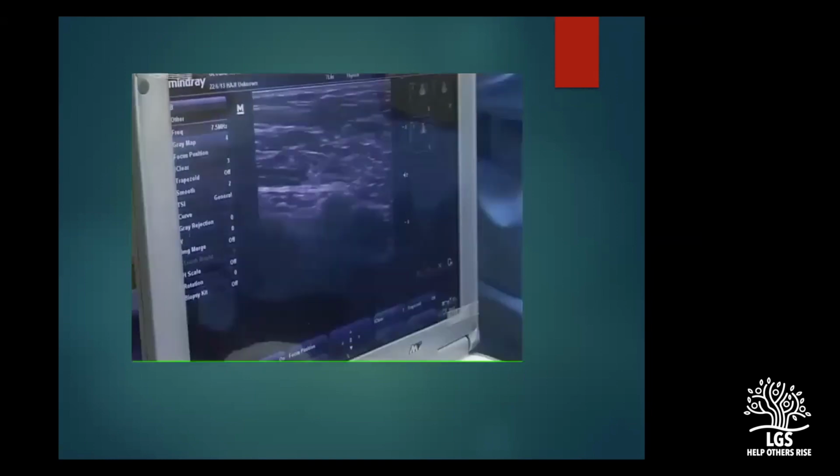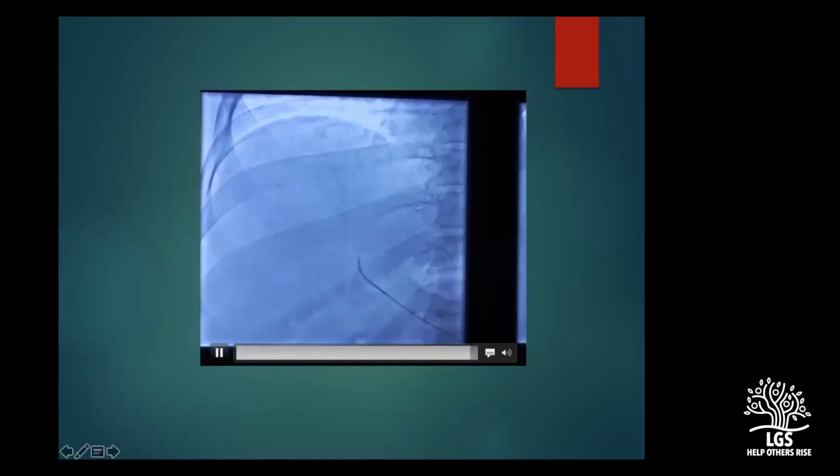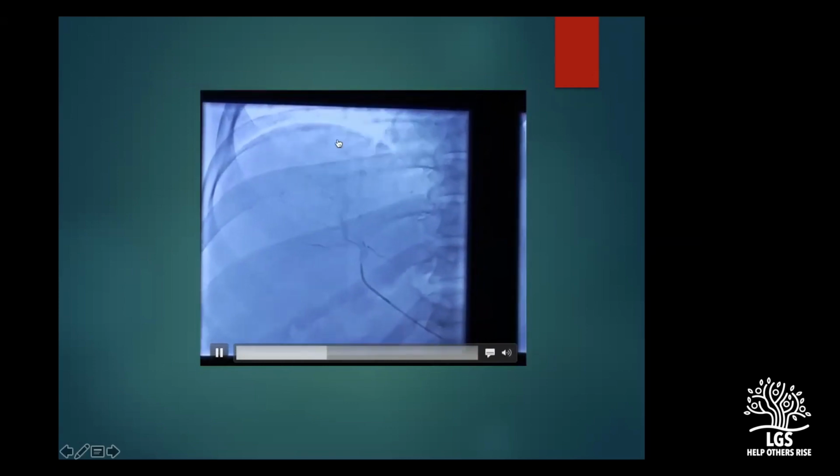Otherwise, you can just go for a blind puncture. And once we puncture the artery, we just get inside, and this is the angiogram. What you see is a tumor blush. So we know that it's SMA supply, it's hepatic arteries coming off the SMA. So I know where to go in, and as soon as we go in, you see a nice tumor blush.